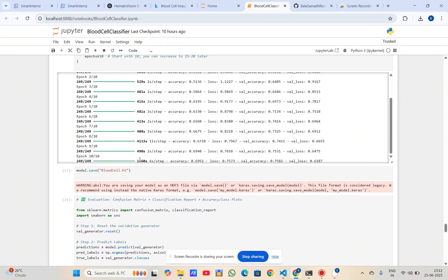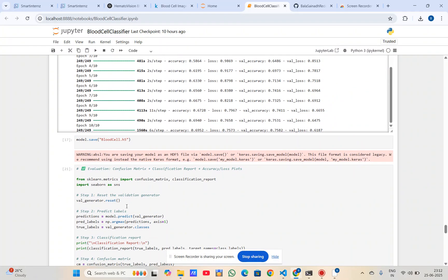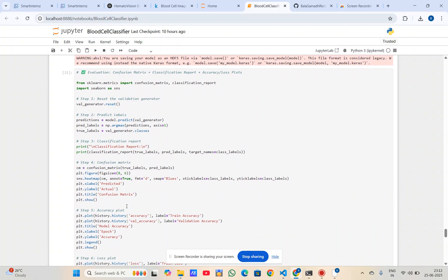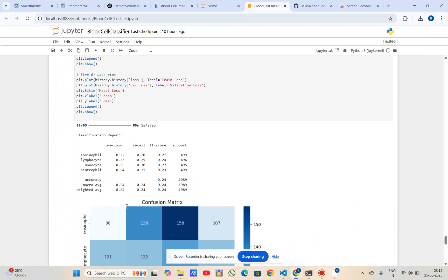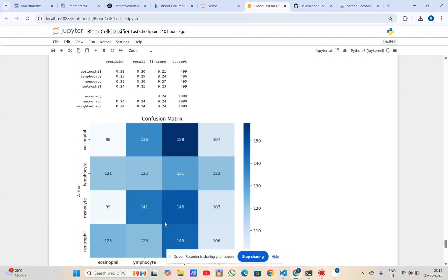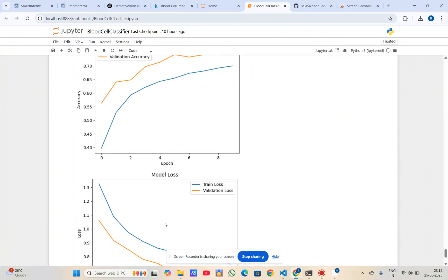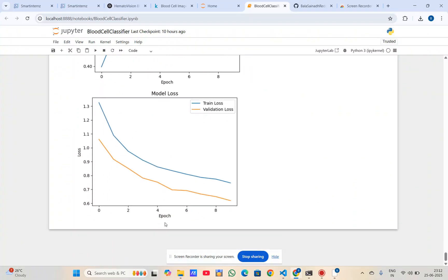After we created and trained the model with our data, we saved it using the command model.save. We then evaluated the results using the confusion matrix and the accuracy and loss curves. This covers the model development and evaluation.